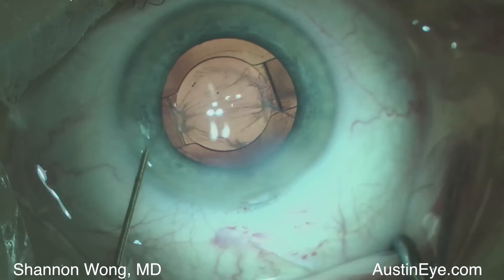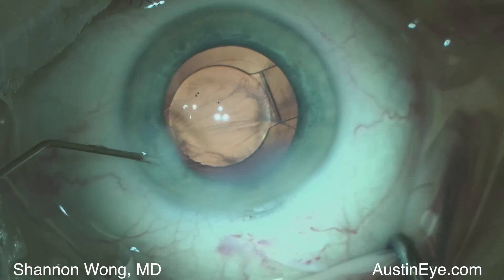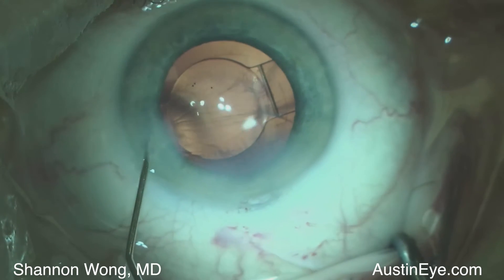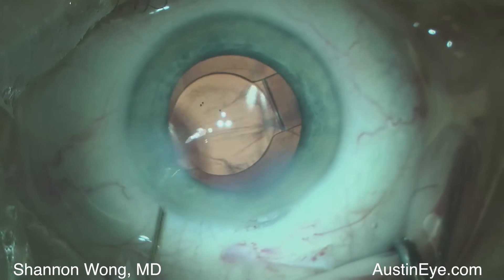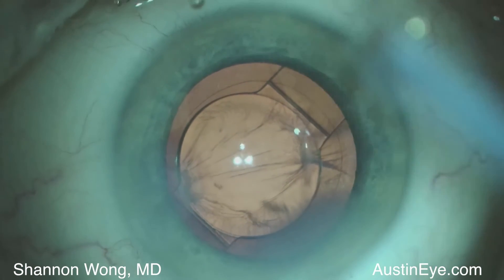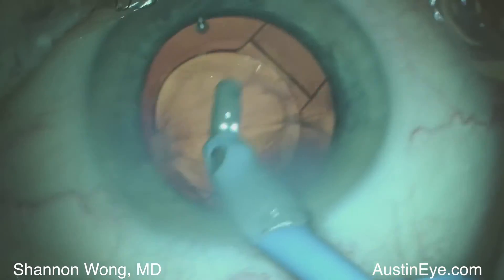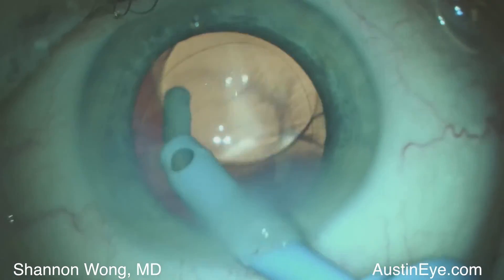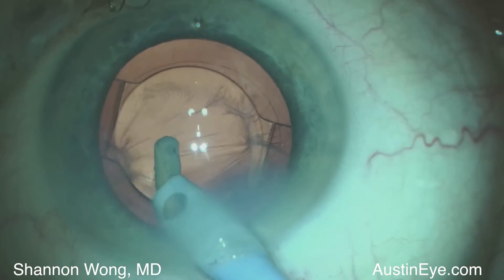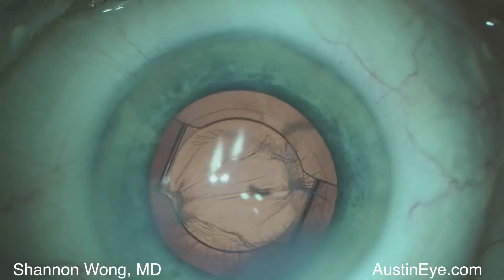We then refill the eye with balanced salt solution and test to see if the Z syndrome is resolved with the Crystal lens in this orientation. In this configuration the rightmost haptic is anterior and the leftmost haptic is still posterior. We try yet again, inserting the irrigation and aspiration instrument to place the Crystal lens in a position it has not yet been placed, then re-inflate the eye.